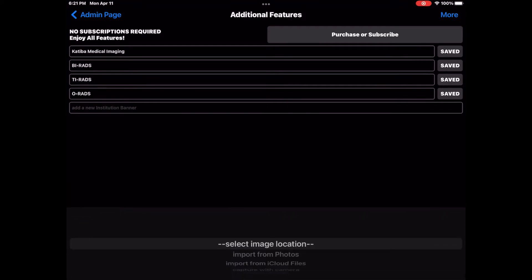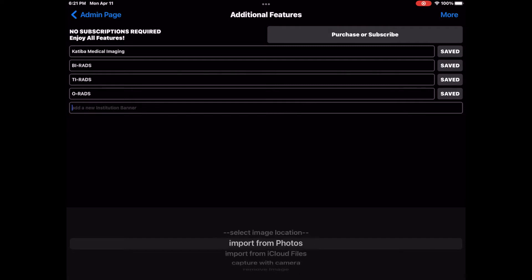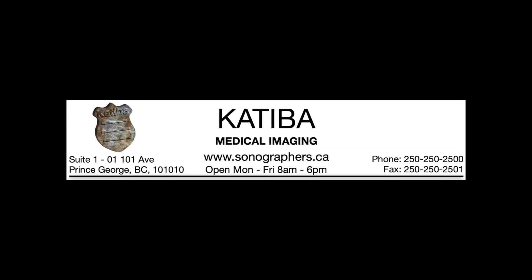There are three options for adding a header banner to your reports. If you have a copy of your banner in your Photos album, select Import from Photos and select the image from your Photos.